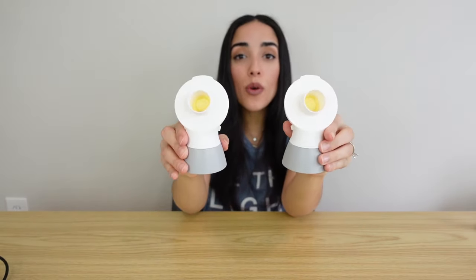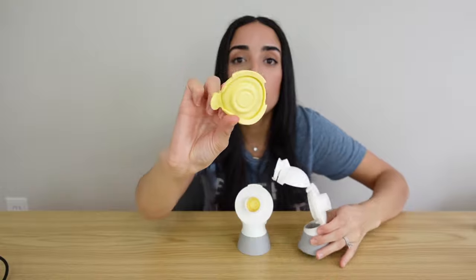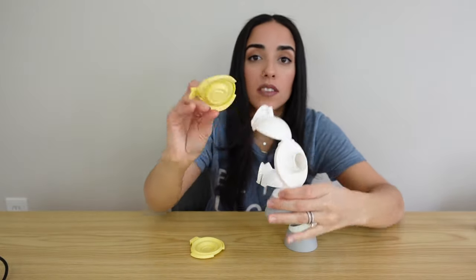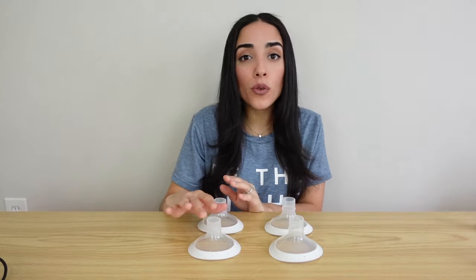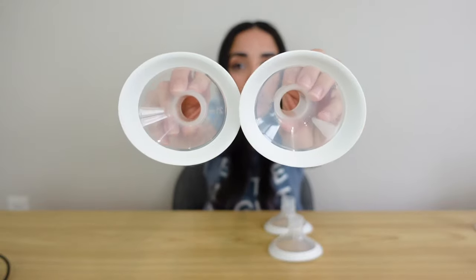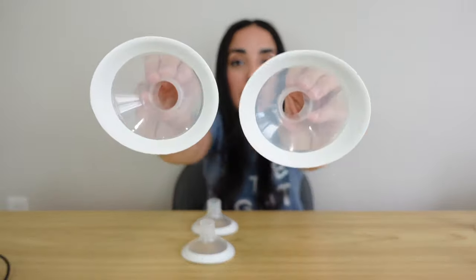You're also going to get two breast shield connectors, and inside each connector you're going to find two membranes. Your pump also comes with two sets of different flanges — four flanges total. Two of them are 21 millimeter and the other two are 24 millimeter flanges.